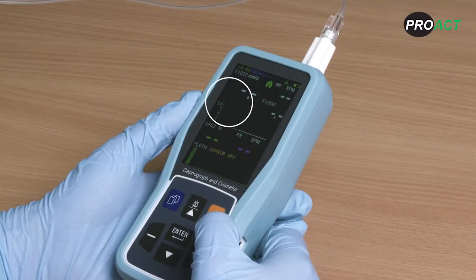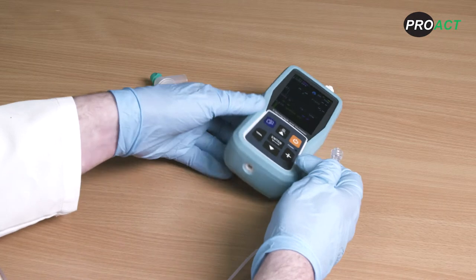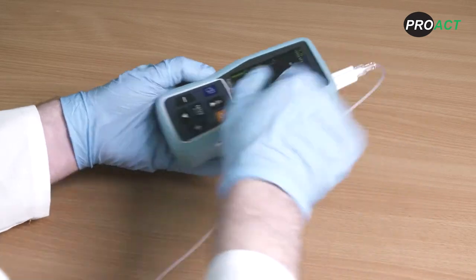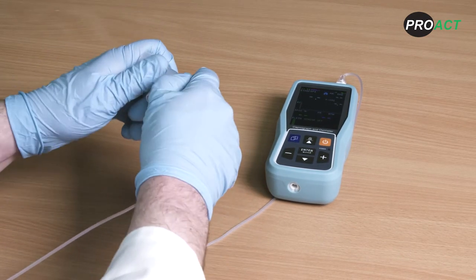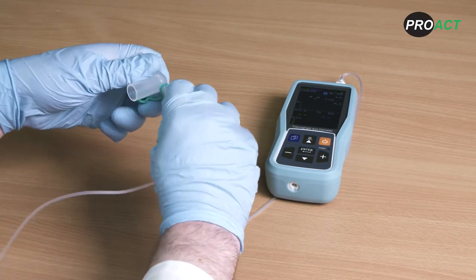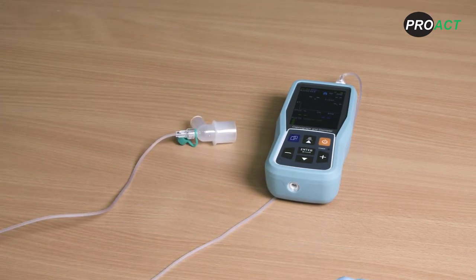Should the water trap filter or sample line become occluded or blocked, firstly check that there is not a problem with the sample line. If the sample line is not blocked, you will need to change the water trap filter. Once attached, connect the male-to-male lure line. It is very important that there are no leaks in this area as air ingress may affect the results shown on the monitor. The other end of the lure line can be attached either to a breathing filter or to a T piece to sample gases from the patient airway circuit. For best accuracy, the gas sampling point should be as close to the patient as possible.